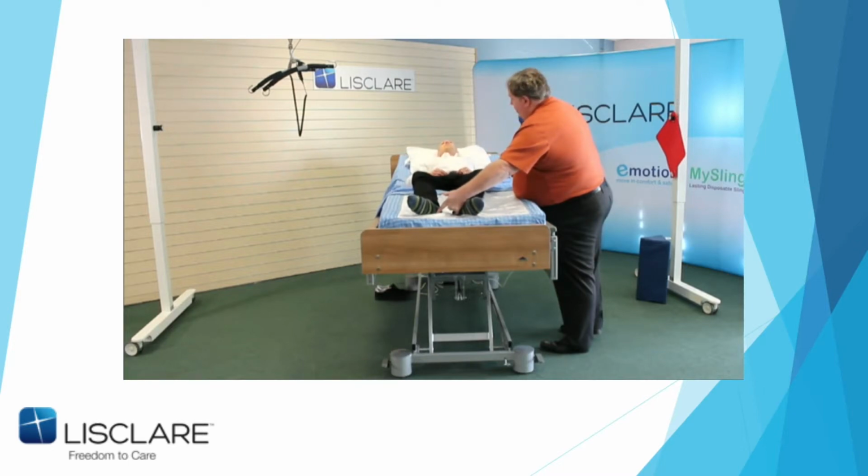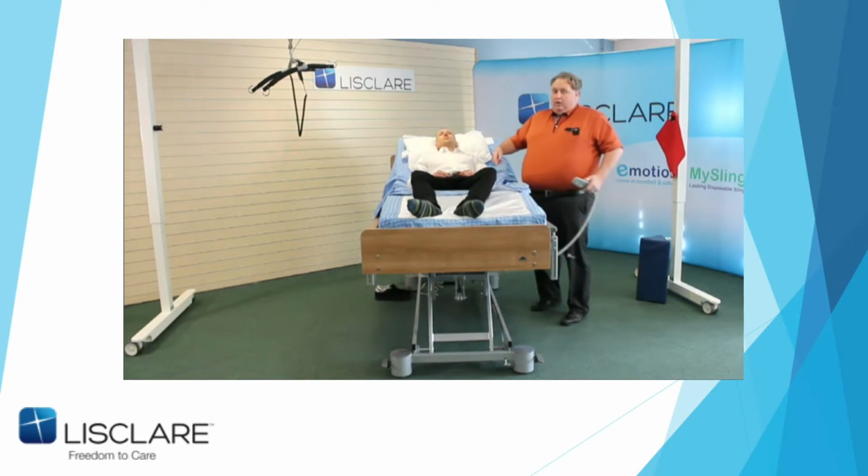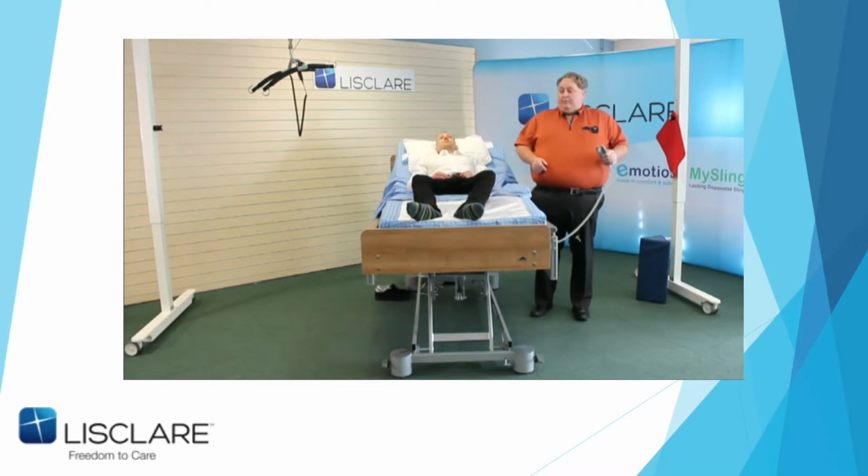Now you can see why I was so adamant about having a low footboard, because you can see John's feet now do not touch the end of the bed. So at no point have I compressed John into the bed that way, or he's never felt the need to lift his hips and slide down the bed. So that when I bring him back down again, I'll just go completely flat with the auto contour.